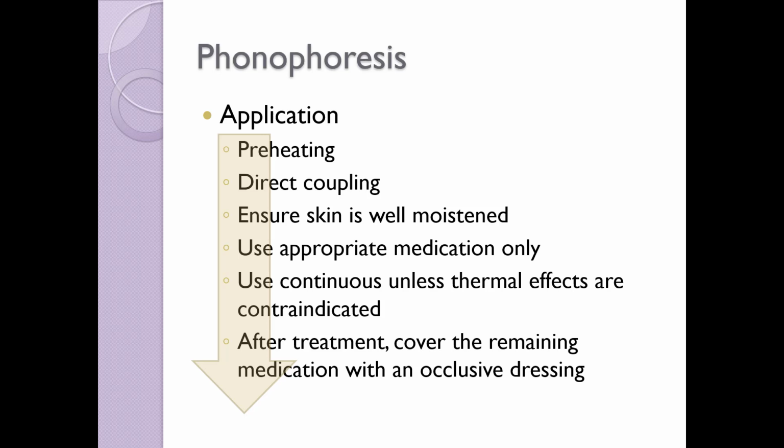Use appropriate medication only. Phonophoresis is the use of prescription medications, which are regulated by most state pharmacy practice acts. Although there is variation from state to state, the law may require that the medication be specifically prescribed to an individual patient. Use continuous ultrasound settings unless thermal effects are contraindicated, such as those of an acute injury. After treatment, cover the remaining medication with an occlusive dressing.